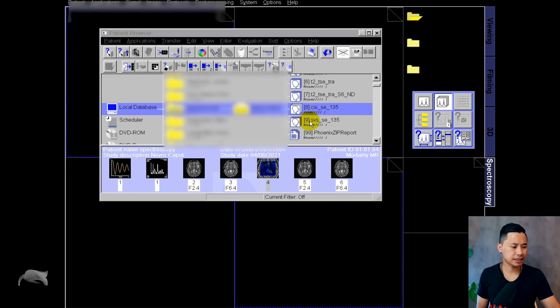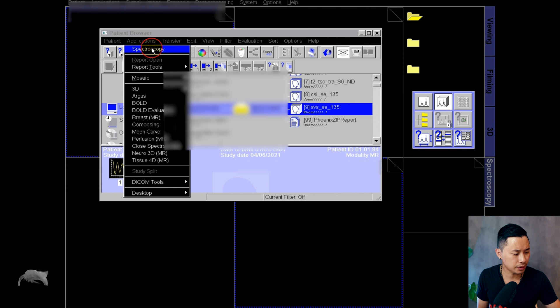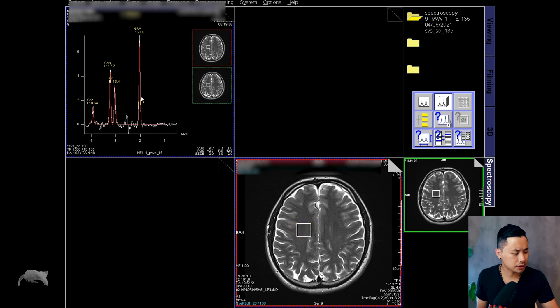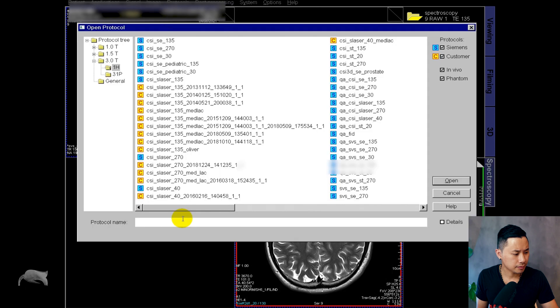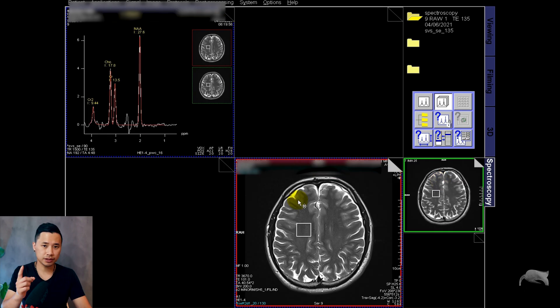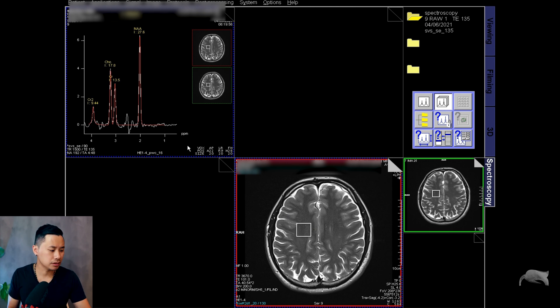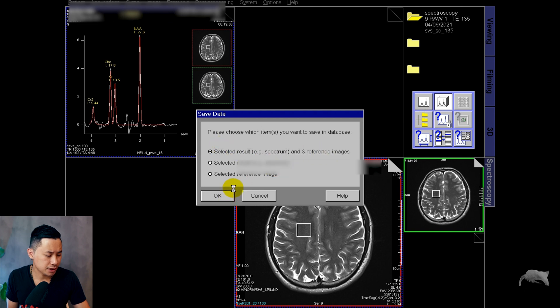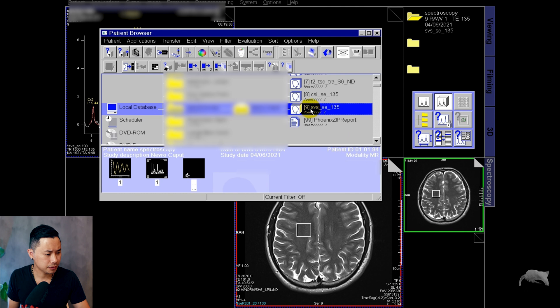Let's close this dataset and check the single voxel. Open the spectroscopy application — the first sign is that the curve looks great. Open the presets and find the right protocol — it's single voxel spin echo 135. It's just one voxel and you can see it's normal — going upwards. Whenever the curve goes downwards, it could indicate pathology. Save that one as well, and when you open the browser it will be there ready to send to PACS.